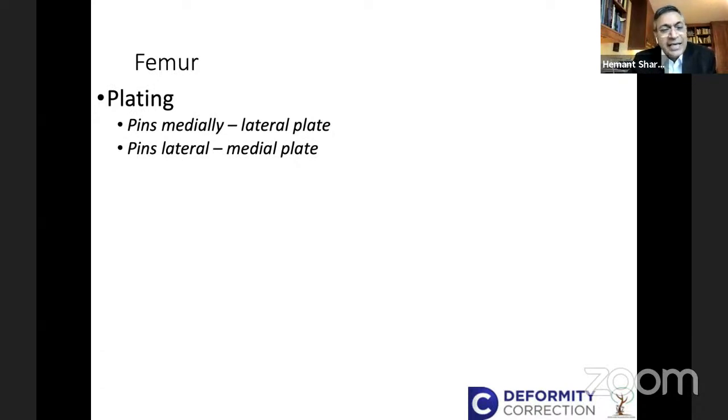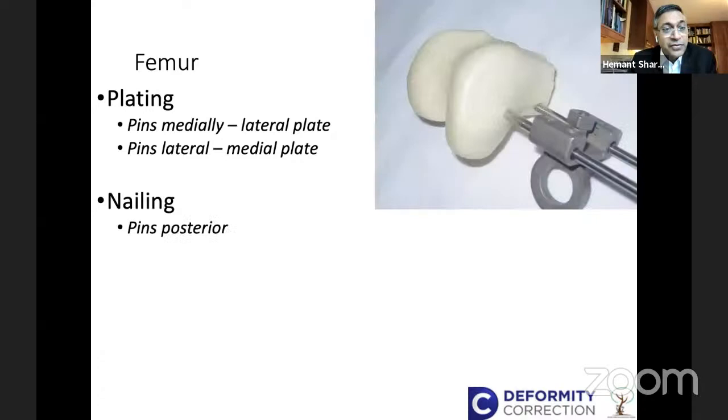It is quite easy. The Liverpool group, Durai Nayagam, has described the submuscular plate quite easily. I have to say I haven't done many, probably one, but it's a very good technique. And there's a cadaveric video of it, which we'll be releasing in time, which will be online, hopefully for you to see at some point if you want.